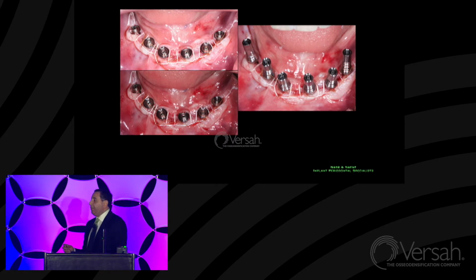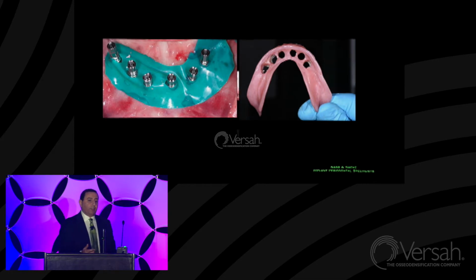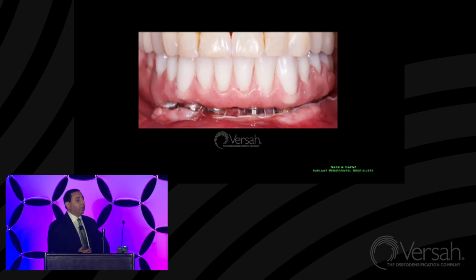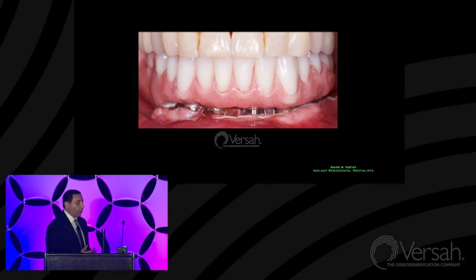So I must say that the fact that I was densifying the bone and not removing bone made me feel a lot better. Yes, it was not wise to place an implant in the midline. I should have listened to my teacher from 30 years ago at the Brånemark Clinic, but that's what the prosthodontist wanted. And typically, I've learned when I accommodate sometimes restorative requests that don't make surgical sense, I end up paying the price. So just go with your information, go with your knowledge, and follow biology.